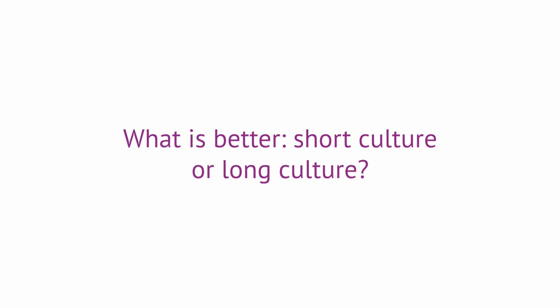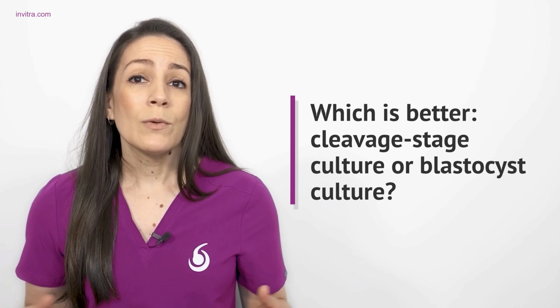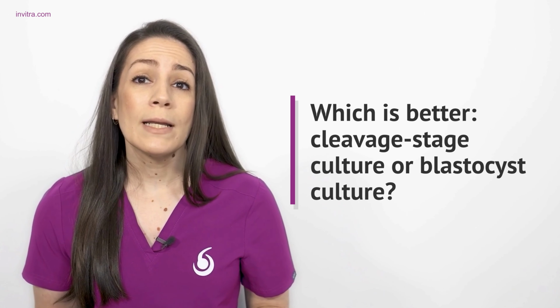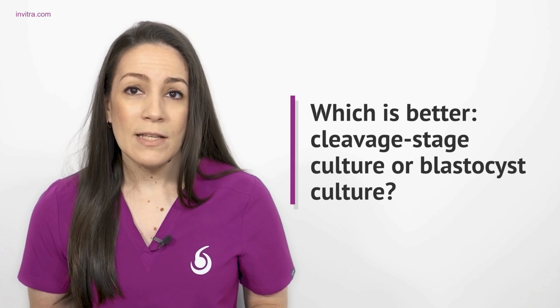And now we are going to answer the most frequently asked questions related to this topic. What is better, short culture or long culture? The reality is that the decision should be evaluated on a case-by-case basis. If we opt for short culture, the process is less complex and gives us the peace of mind that if we start with few embryos, there are more options to have one available at the time of transfer.